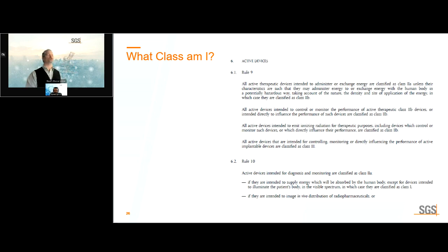So everyone's used to looking at these. I want to give you some insight into how a notified body looks at this. So if we see someone say, I'm Rule 9, Class 2B, that doesn't tell me that you know why. Because if you start looking at this, you'll see there's more than one way inside of Rule 9 to be Class 2B. Now, you're software only. And people might be thinking, well, I can't be Rule 9 or Rule 10. I'm software. That's what Rule 11 is for. But multiple rules can apply to one device. So it's important to read them through.